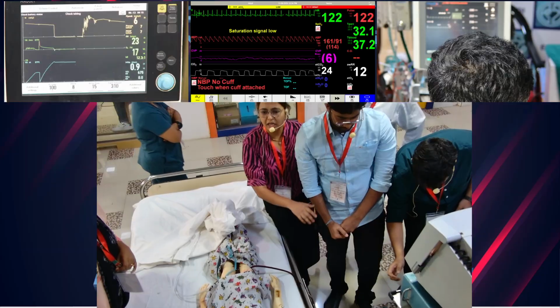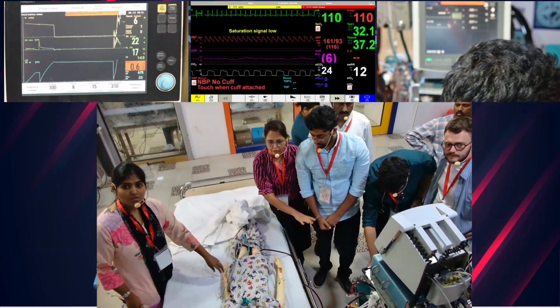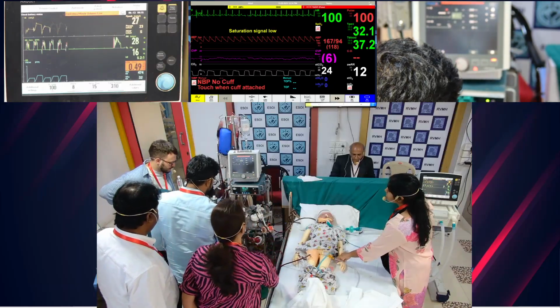We would like to reduce the RPM since the pressure is getting more negative. Probably cavitation is happening, so I would like to reduce the RPM. You do whatever you want. Reduce the RPM.